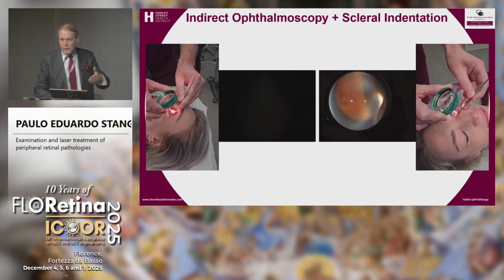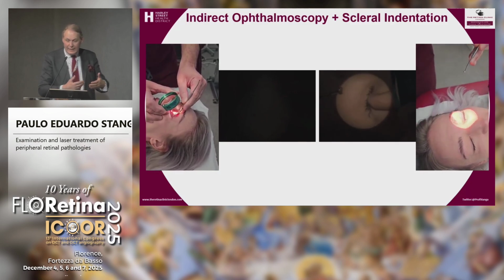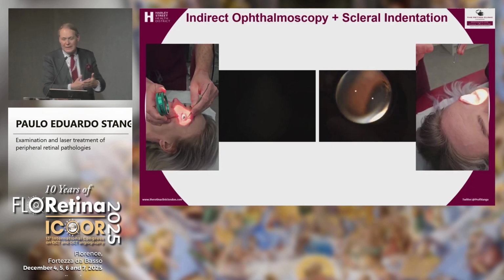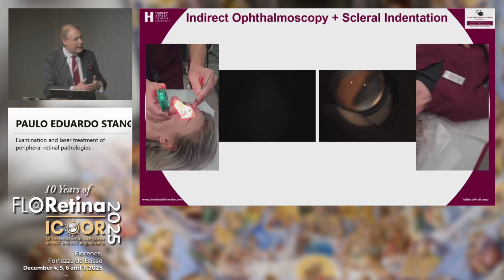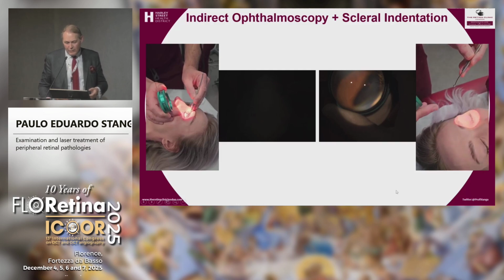All you need to do is place the indentor and ask the patient to look up, and the space that the indentor occupies is enough to cause the indent. You don't really need to press. And you saw it. 2 seconds, I'm directly over the ora.